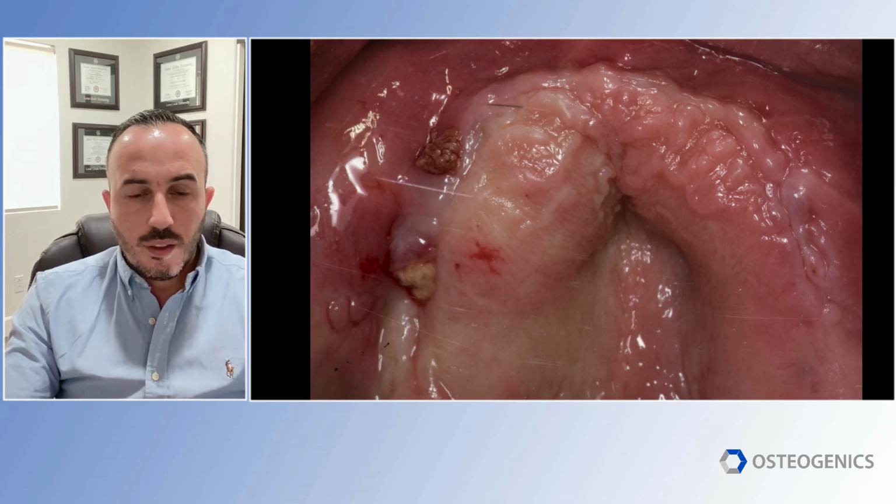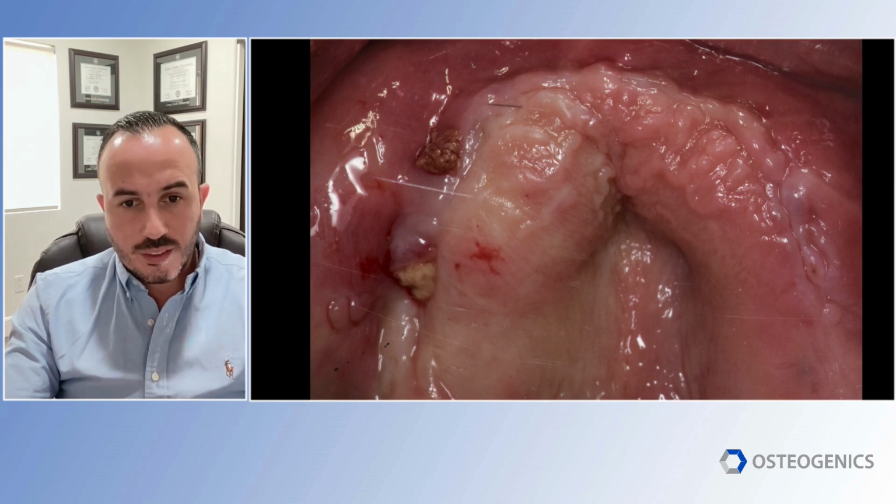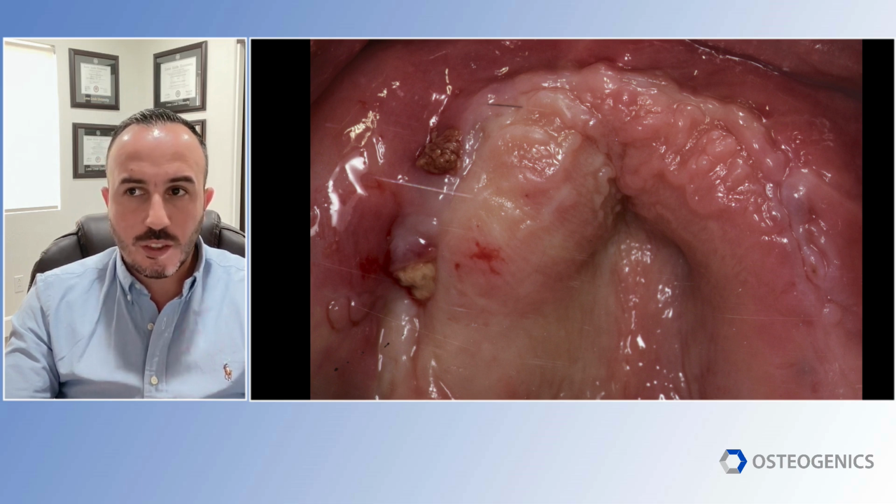At 3 months, patient had that site where it was the weakest point, because patient had extraction, so that was the weakest point to cause problems, and the tissue was not mature enough. So that's where the membrane decided to peek through. And you can see part of the Cytoplast PTFE sutures is still there, left in there.